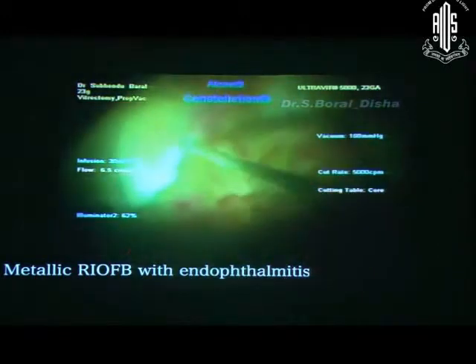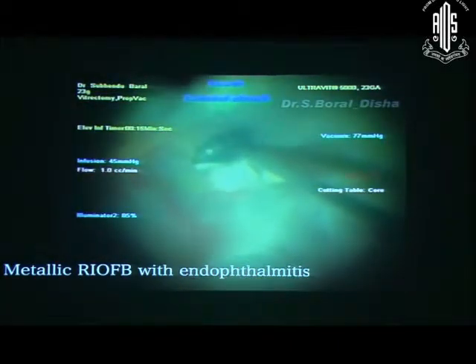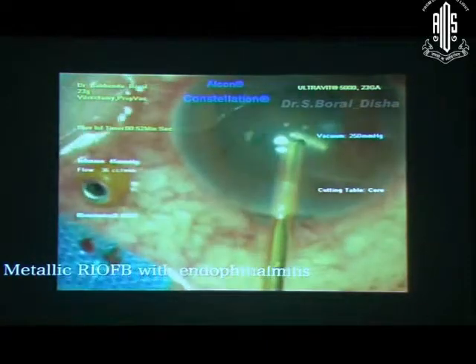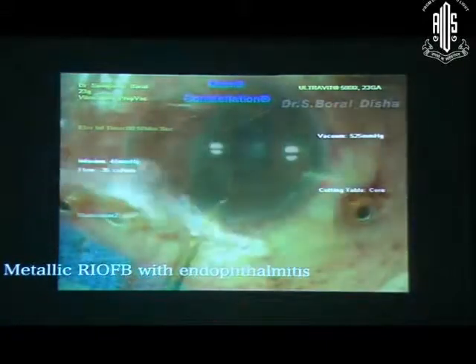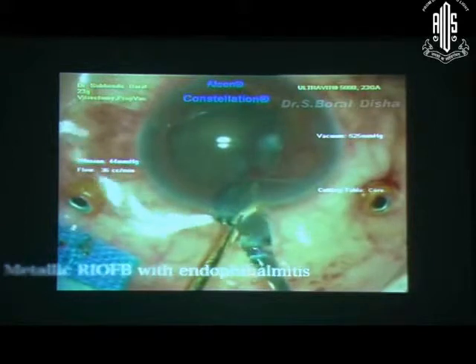This is a case of endophthalmitis with metallic RIOFB. There were a lot of membranes around the RIOFB — I freed it using suction of the backflush needle. Previously I did lensectomy. So through this area I am removing the foreign body with the help of the magnet, and you should extend the limbal wound carefully. Now done. You should do laser around the break and use silicone oil at the end of surgery.